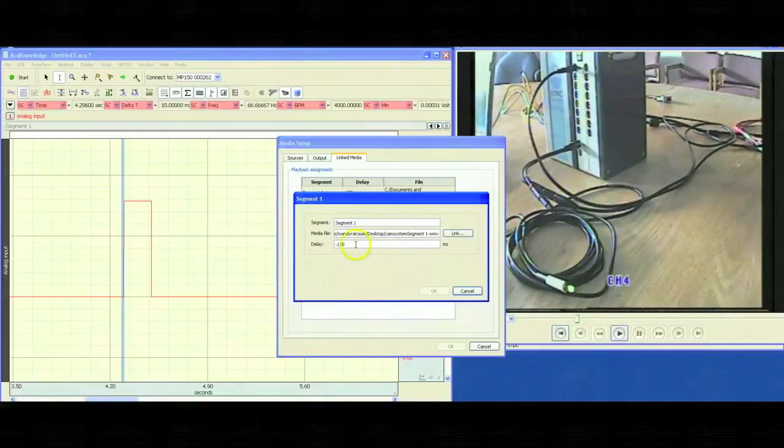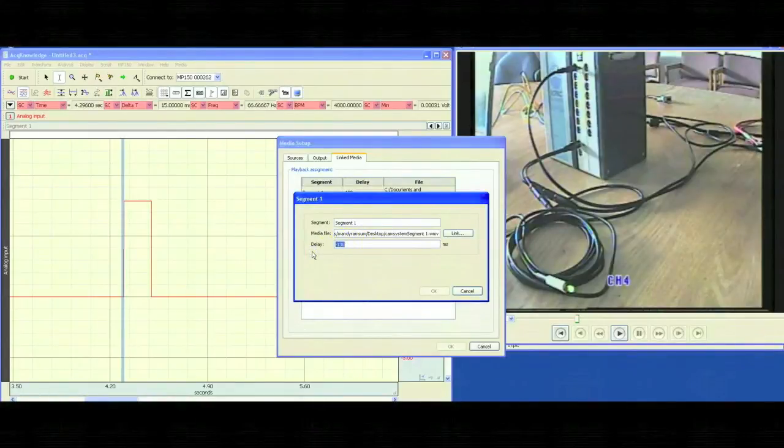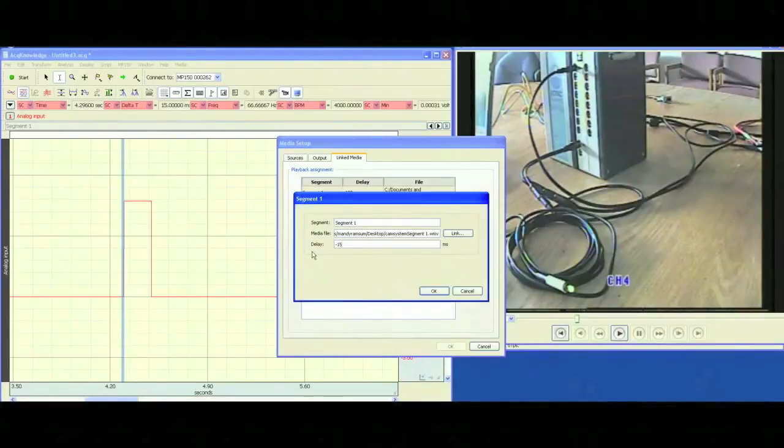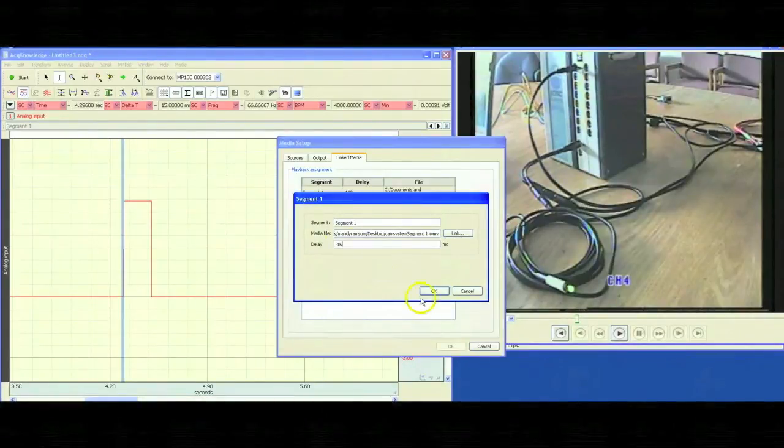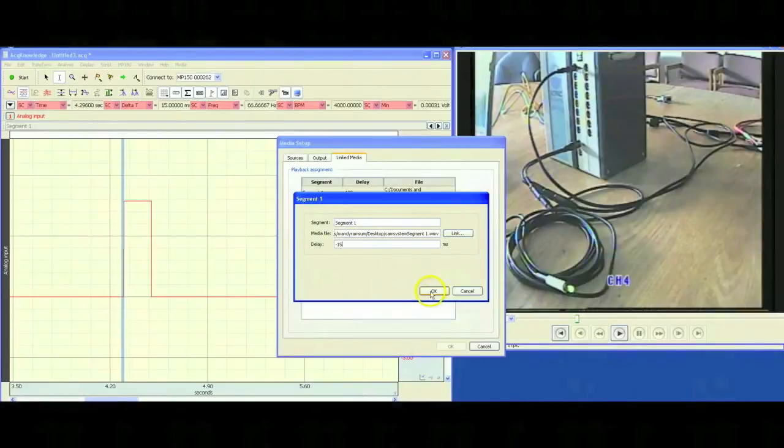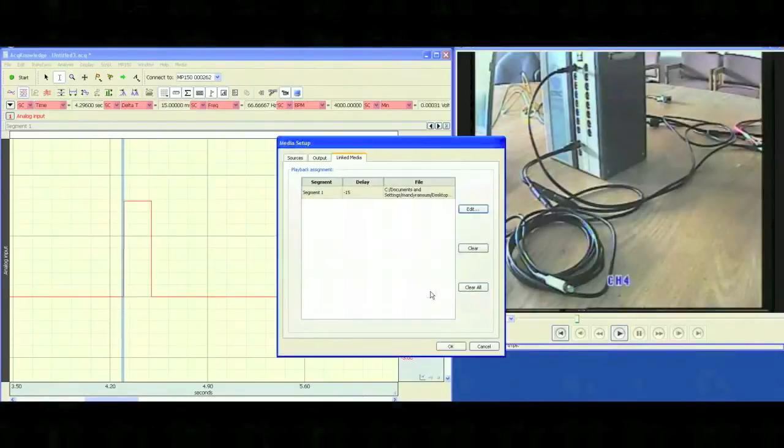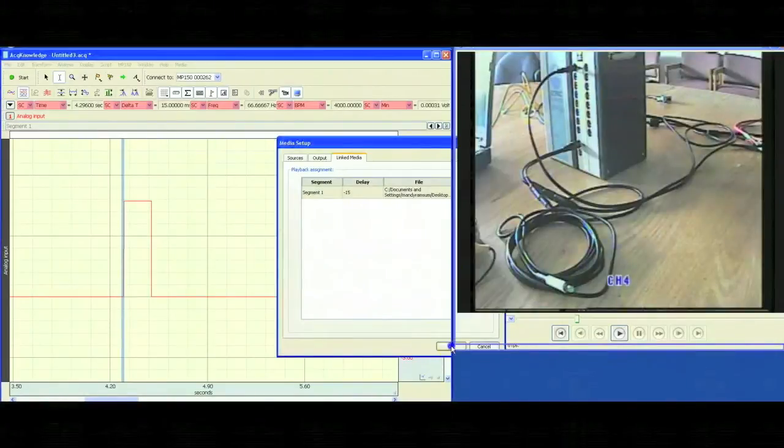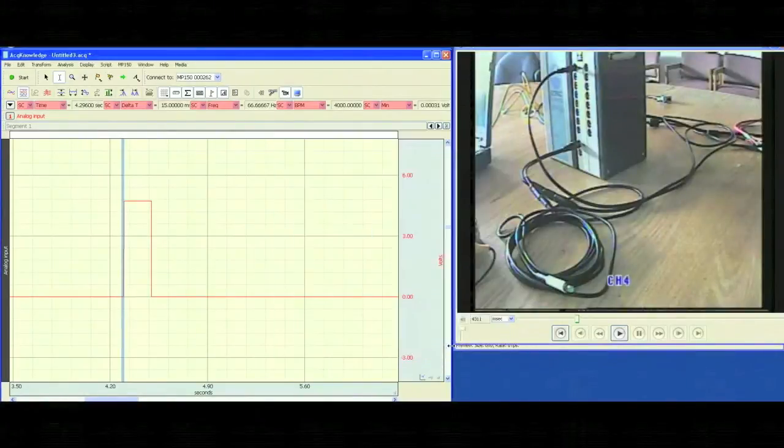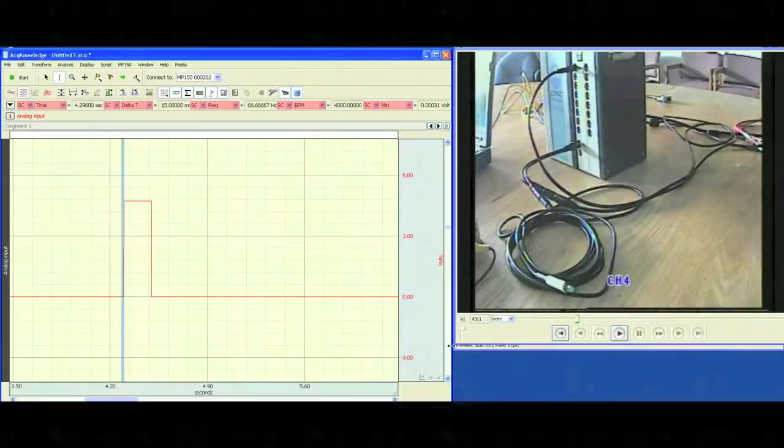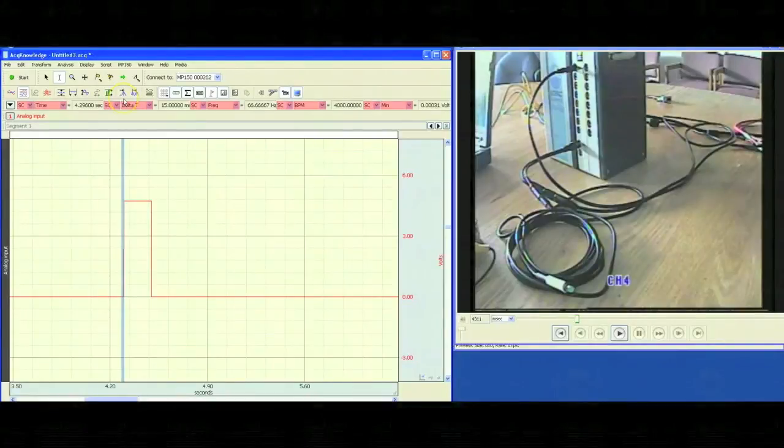Right now, it's set to a negative 130. We can change it to a negative 15 milliseconds. What we're saying is the flash is showing about 15 milliseconds before it's showing in our data. Click on OK, click on OK, and now we're ready to record the physiology with the best possible synchronization.